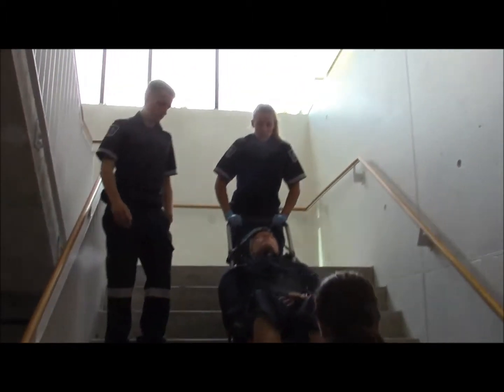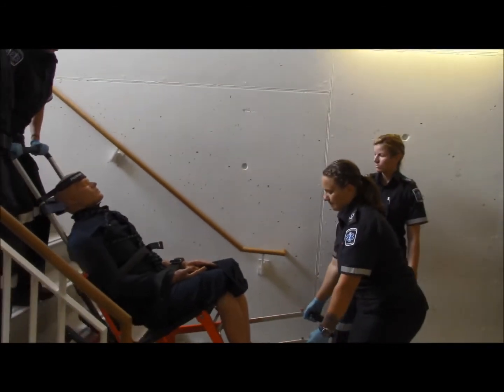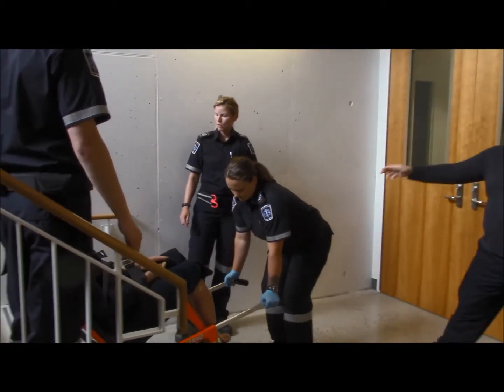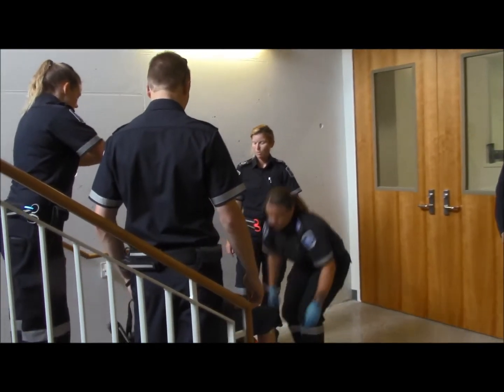And again, it's not so much a lift as it is a guide down the stairs, but it has to be safe and smooth. What we want to see is the chair not bouncing step to step, and so that takes a bit of practice to angle it properly. Again, once you get to the bottom, you'll want to put those handles in if you're going to use all four wheels, as they do tend to hit off the ground. And prepare for part 2.